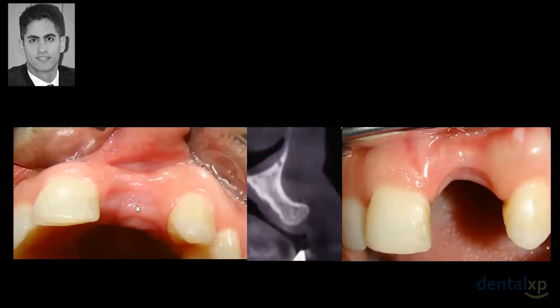This is the occlusal view of the soft tissue. You can see the depression here, and this is the CBCT scan of the patient. You can see in the crestal area the bone width seems to be good, but about 2 to 3 millimeters below that we're going to face this deficiency. And according to the previous slide I presented to you, you can see the level of the soft tissue is different on tooth number 8 and the area of tooth number 9.